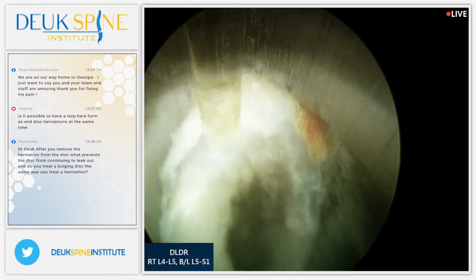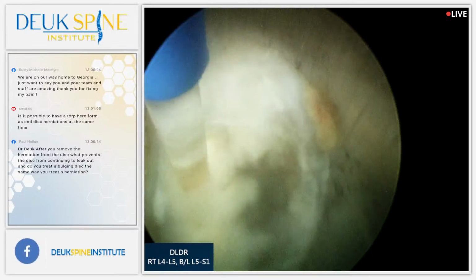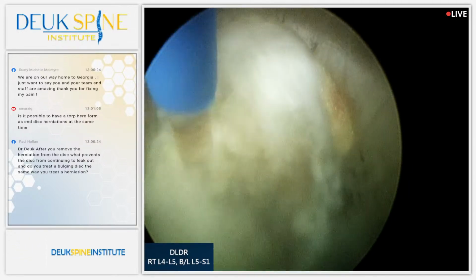All right, just about done here at L4-5. We have a couple more questions.